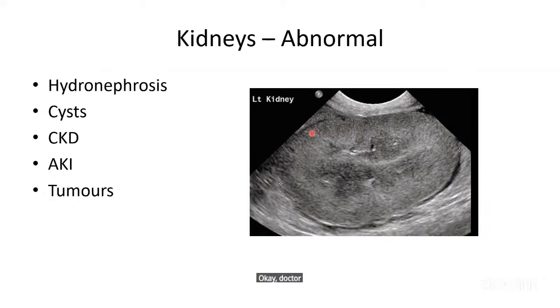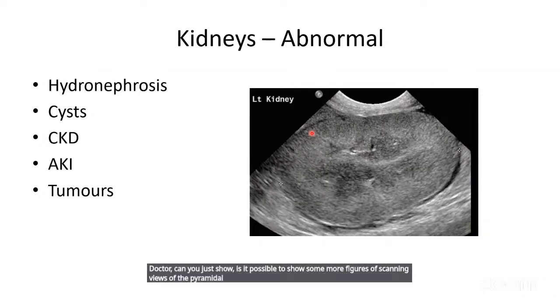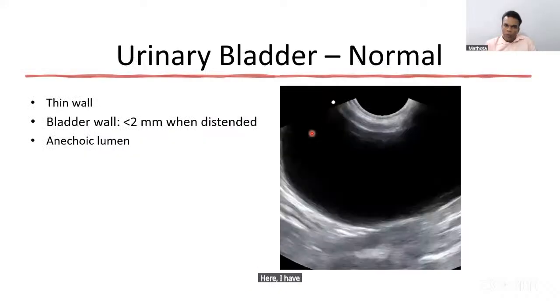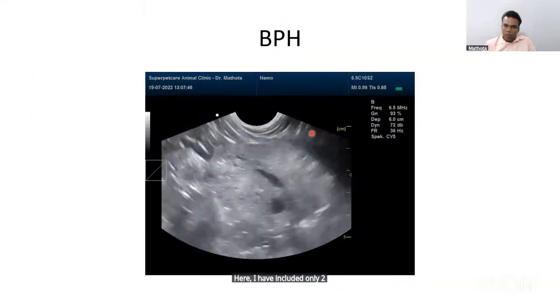Doctor, is it possible to show some more figures of scanning views of the pyometra cases in different animals? Different animals, dogs and cats. Here I have included only two, I think.